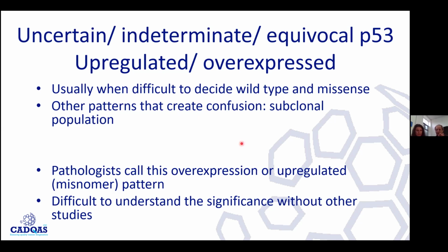And then the second point is when you have little areas that show mutant pattern and areas that don't show mutant pattern. It's very difficult when you have wild type combined with loss in particular. It's easier to see when it's overexpressed. We need to understand that this situation will occur. Usually, the P53 mutation is pervasive in the tumor cell population, but not always. As pathologists, people accuse us of being superficial because we are happy when 80% or 90% of the cases fit the pattern, and we'll go along. What about the 10%? Well, I don't know. We'll put it aside and think about it.